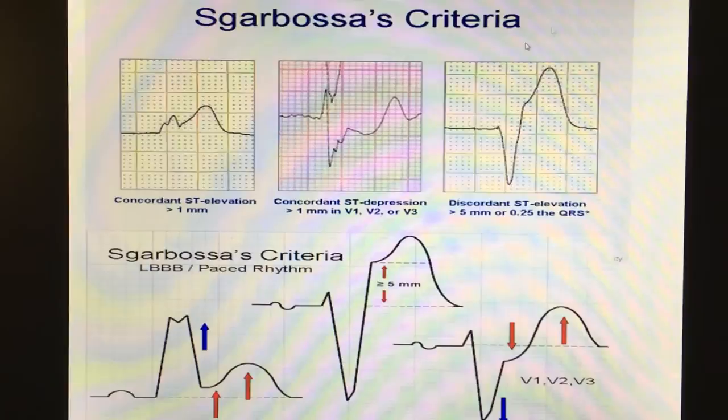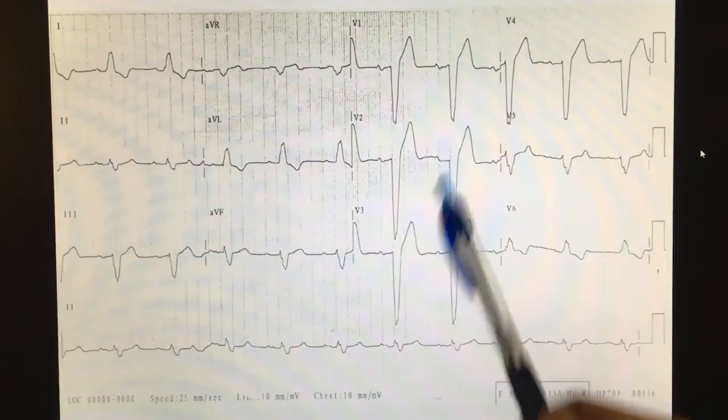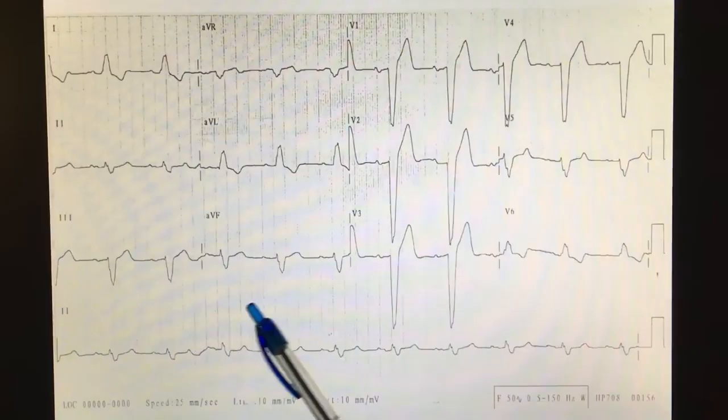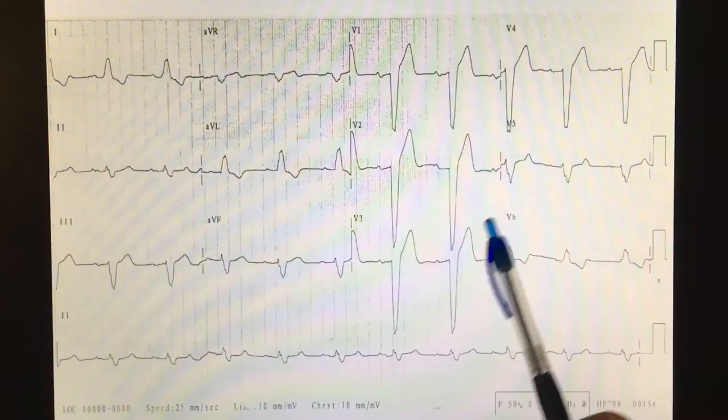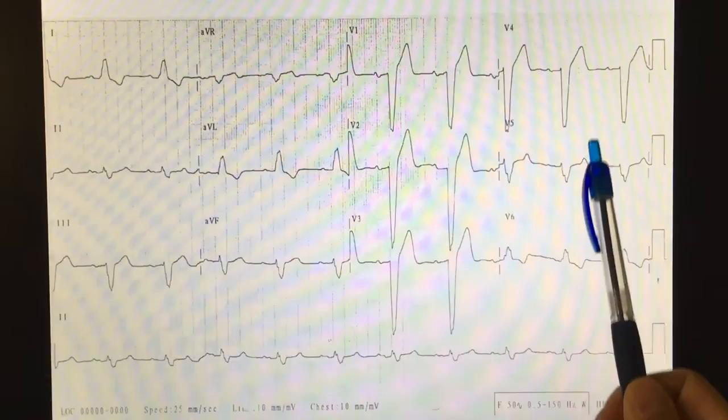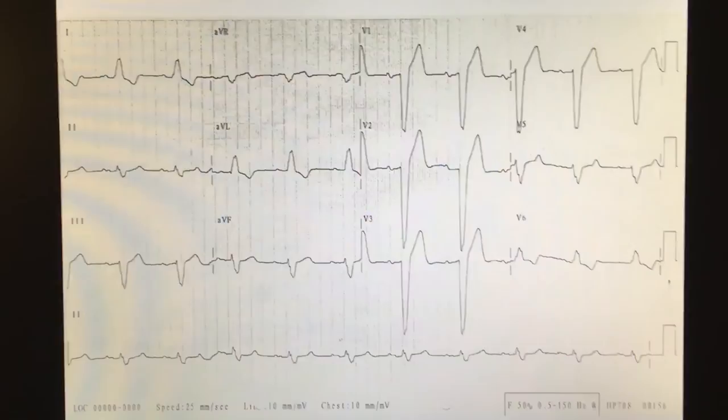So what does that look like on an actual EKG? This is an EKG of a patient with chest pain. You look, and they've got an obvious left bundle. You look for concordance or ST depression. No concordance — everything is going in opposite directions. The QRS and ST are going different directions. And this is, in fact, a normal left bundle branch block EKG.